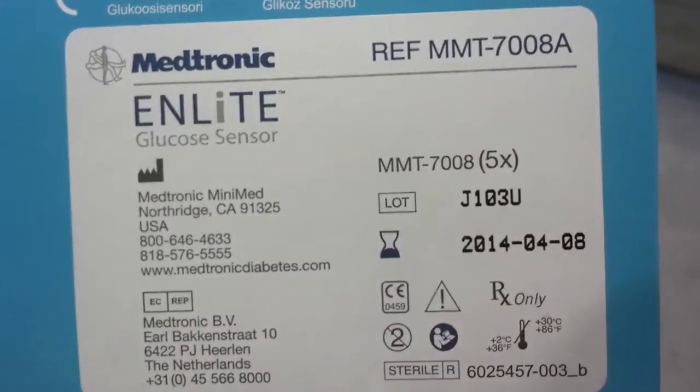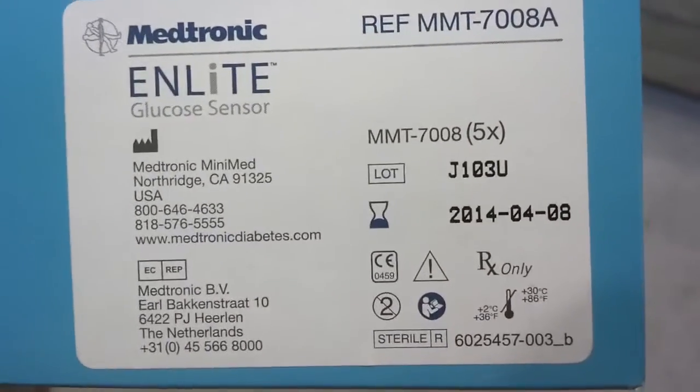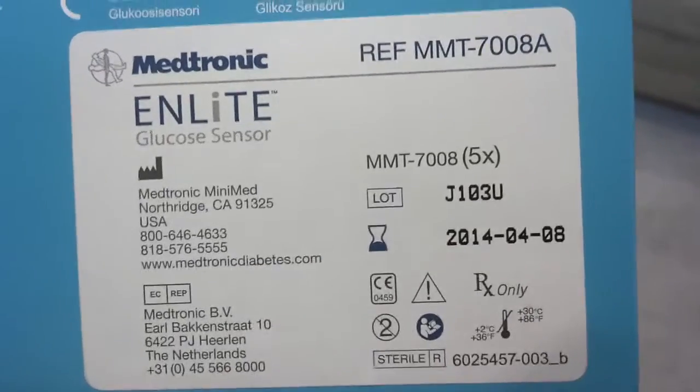I have had two boxes of these — they both came with my starter kit. Both of these boxes contain five of these sensors. I have finished one box, and I've got one sensor still in the box, and I've got one sensor that's not working properly in my abdomen. So that's where I stand right now.